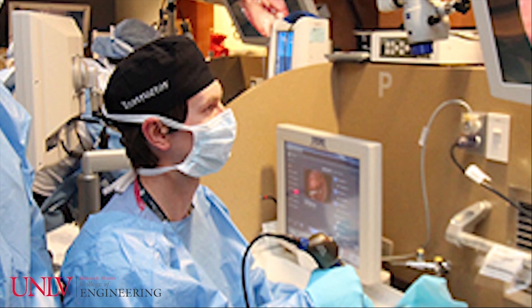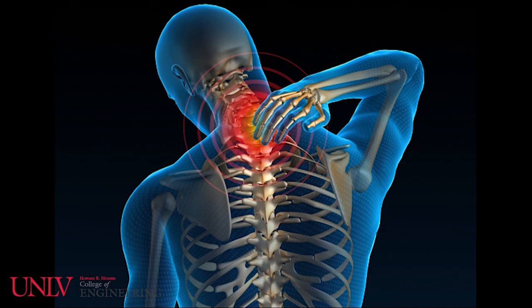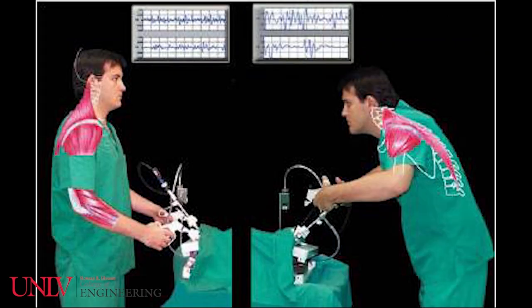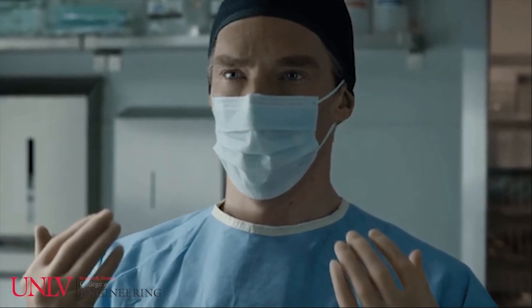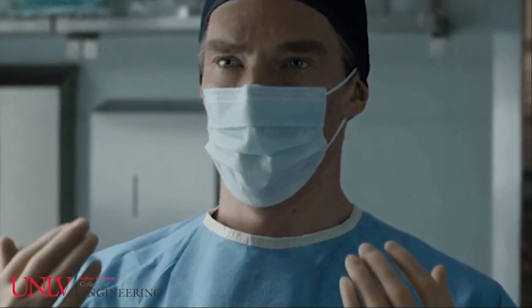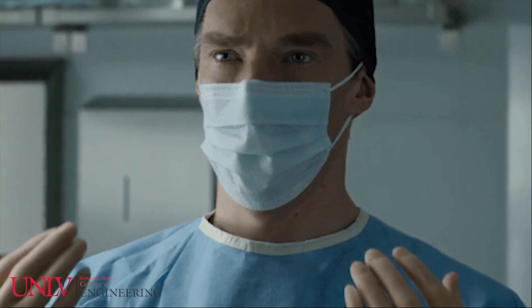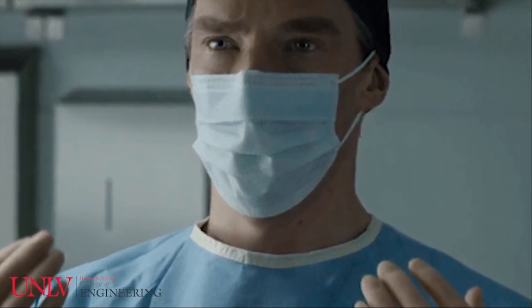Currently, this method of sharing a central screen can force the surgeon and their assistants into very uncomfortable positions, and with operations that can last hours, this can lead to neck and spine injuries in the future. Because a surgeon's main tool is their hands, problems with the neck and spine can also lead to deterioration in fine motor controls, causing it to be more difficult to keep steady hands.